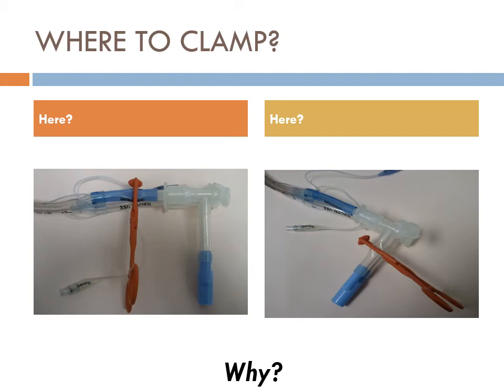So maybe we'll just do a couple scenarios and this might start to click. I put the tube in, it goes into the left lumen. I inflate the tracheal cuff to like 20 centimeters or whatever. It never really fully turns into a balloon. This is a lot of air. We never need that much air.